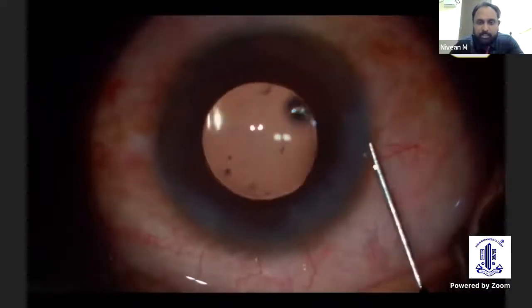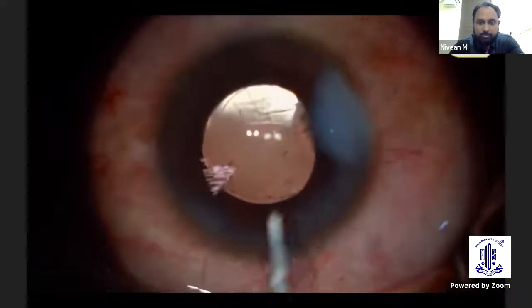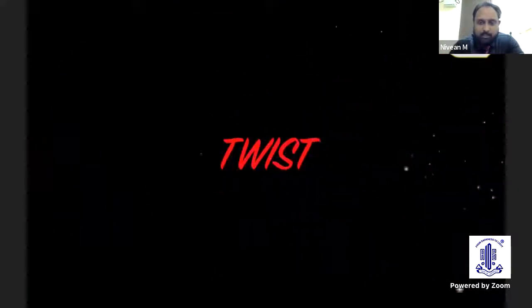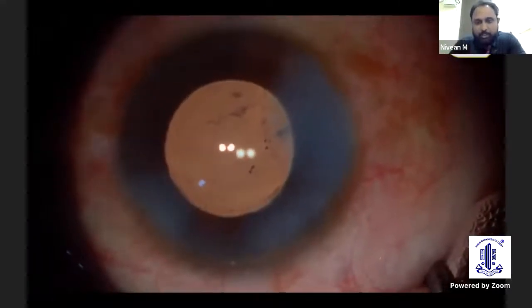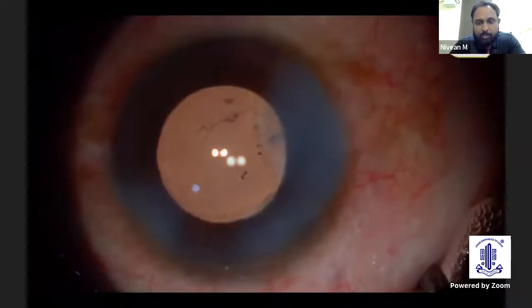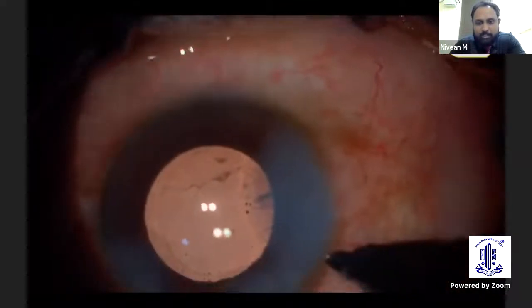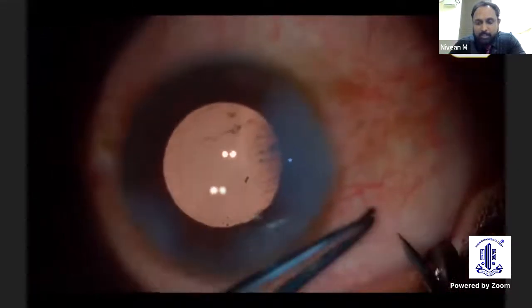So this is just to check there is no vitreous, always, just putting the trocar. But then you can see those pigments on the anterior vitreous face. So here what I had to do is we introduced a trocar here. It could be controversial for discussion, but it is always better to clear the vitreous just behind the lens also.